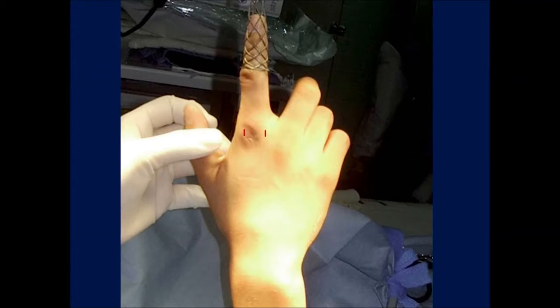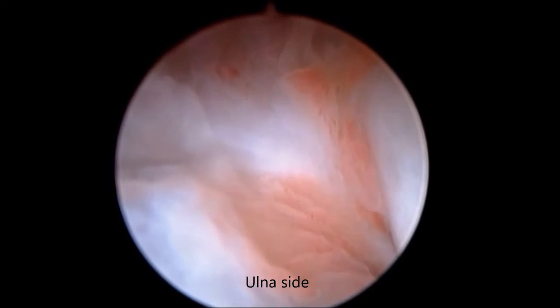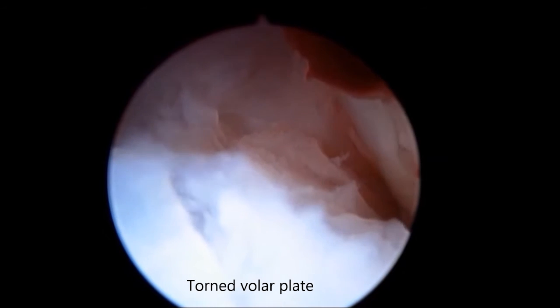Two 5 mm incisions were made to provide portals on each side of the extensor tendon. We used the radial portal as a viewing portal and the ulnar portal as a working portal. We are viewing the MCP joint from the ulnar side to the radial side.